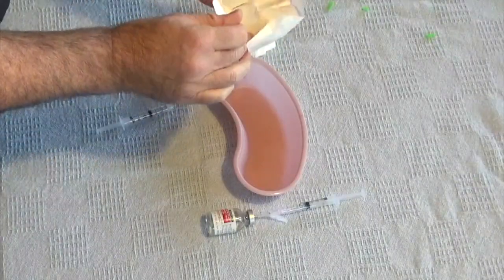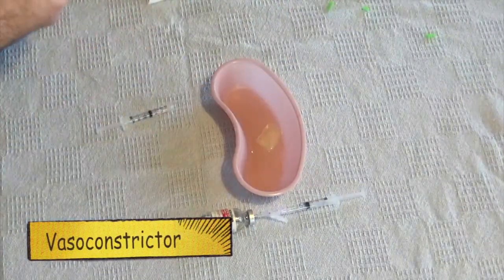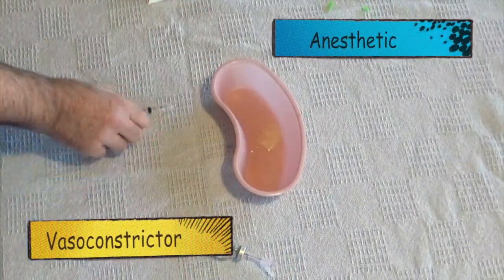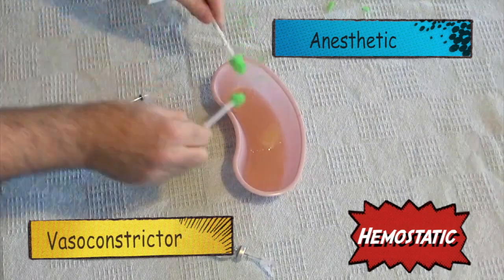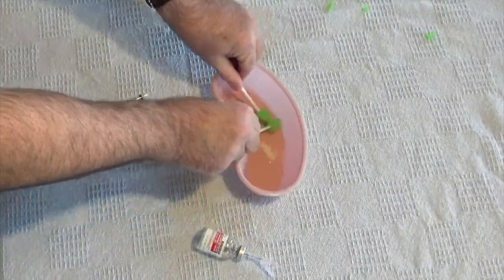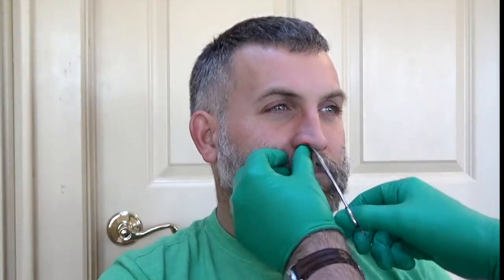Next, take an absorbable hemostatic agent like gel foam or Surgicel, put it in a kidney basin, and squirt it a couple of times with some oxymetazoline or phenylephrine nasal spray, a little bit of lidocaine with epinephrine, and if you have it, a little bit of topical tranexamic acid, and then mix it all together with the little green spongy things.